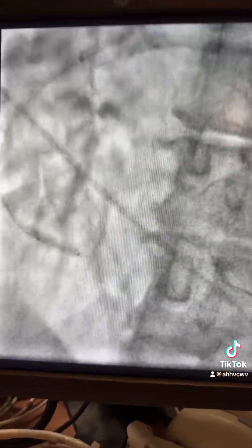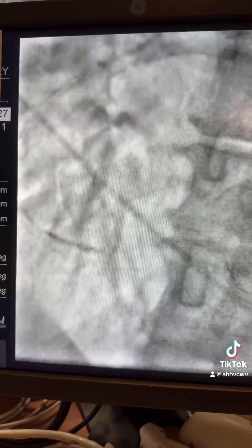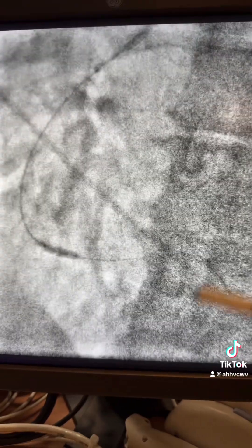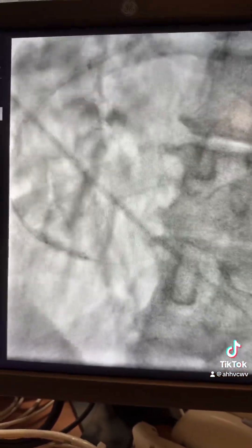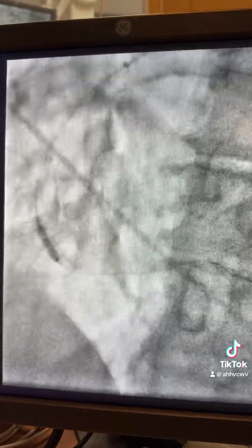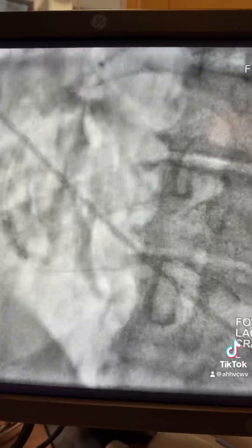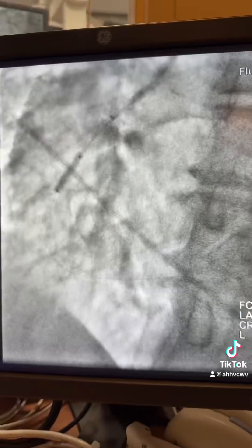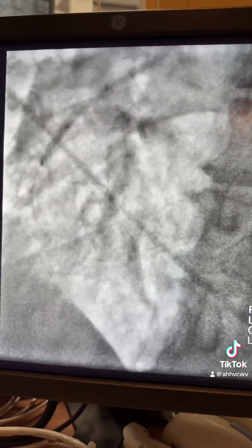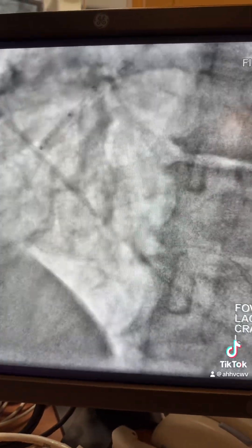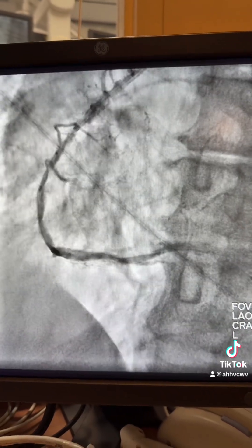Before stenting, I have to use the shockwave — this is a 2.5 shockwave, used all over the vessel. Runs were performed distally, mid-distally, and then proximally with the shockwave lithotripsy. Here is the angiogram after the shockwave.